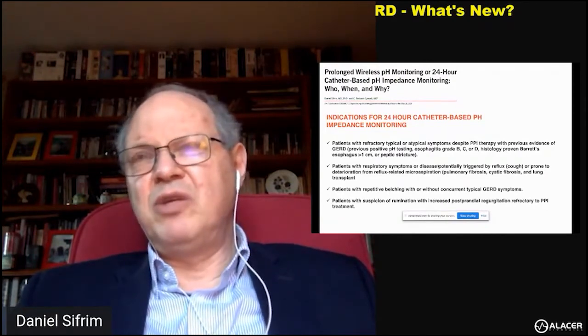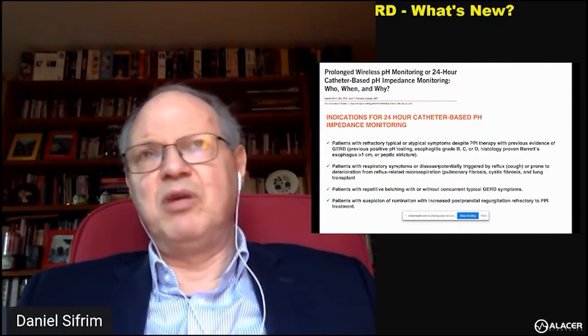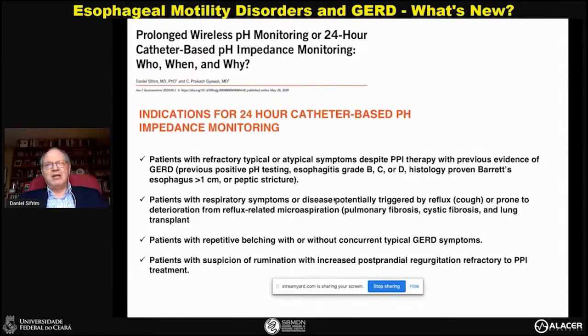So I discussed today with you the principles of impedance, the relationship between impedance and reflux disease in terms of relevance of non-acid reflux, relevance of mucosal integrity measured with MNBI, and relevance of mucosal clearance as measured with impedance with PSPW, the relevance of impedance in the understanding of belching and aerophagia, which is a universe that has been completely ignored or impossible to measure with pH metry or with Bravo, or even with mucosal impedance, in which you cannot see reflux of air, of course. And finally, the possibility to diagnose rumination.